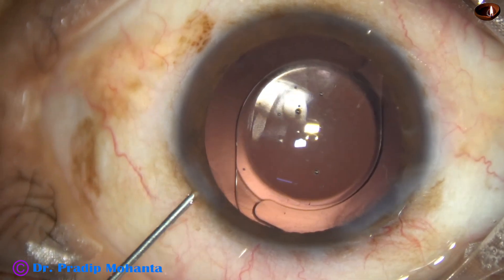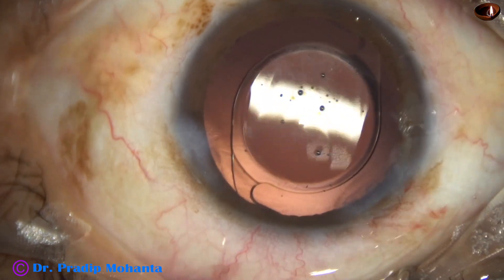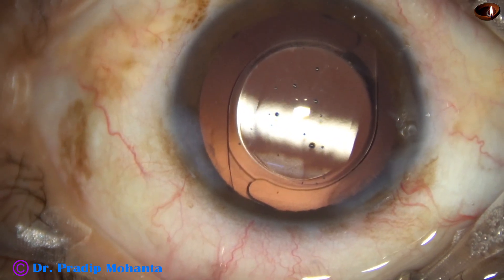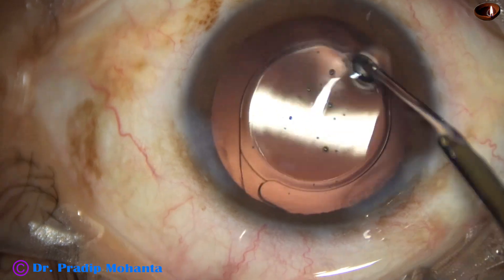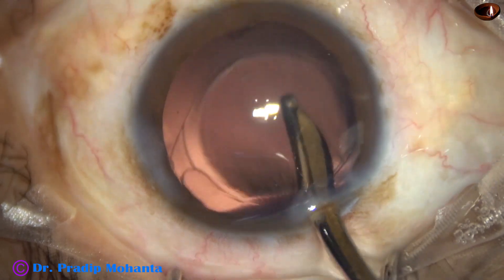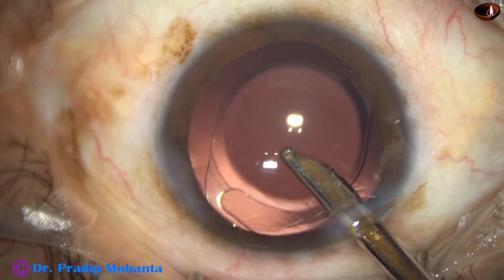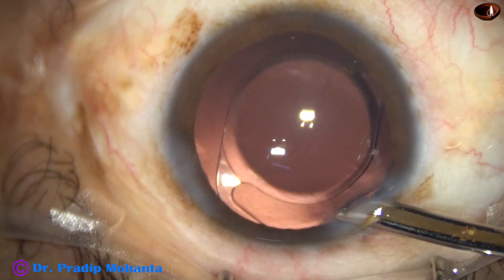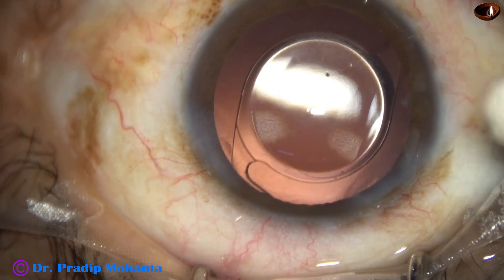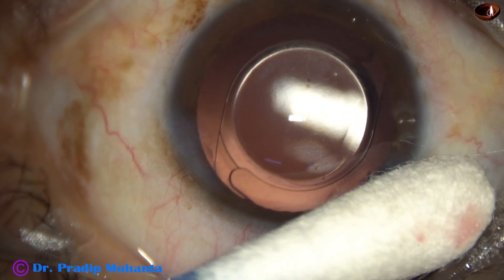This is moxifloxacin. Now the side port is closed by stromal hydration. The main wound is triplanar and self-sealing — it does not require any hydration most of the time. In 99% of my surgeries, the main wound does not require any hydration. This is formation of the anterior chamber. Integrity of the wounds is checked — there should not be any leakage from any wound. A few drops of moxifloxacin are applied over the ocular surface, and the case is concluded.